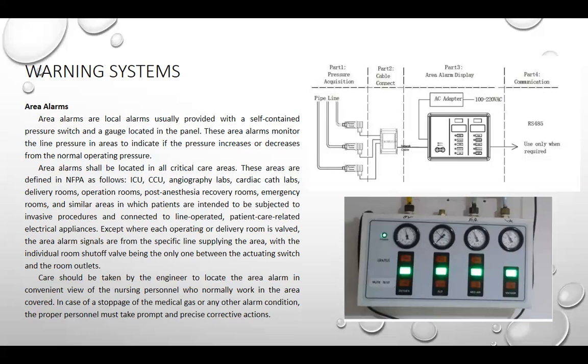In case of stoppage of the medical gas in the area covered, or any other alarm condition, the proper personnel must take prompt and precise corrective action.